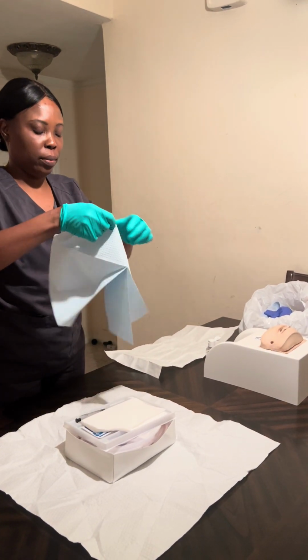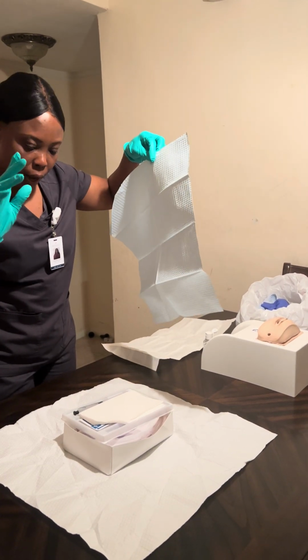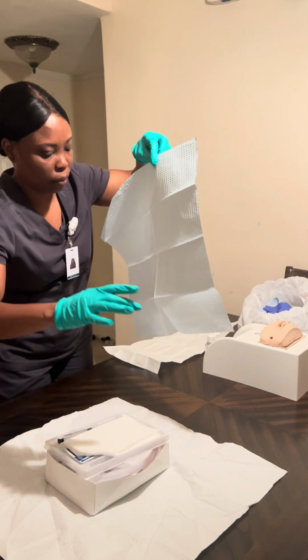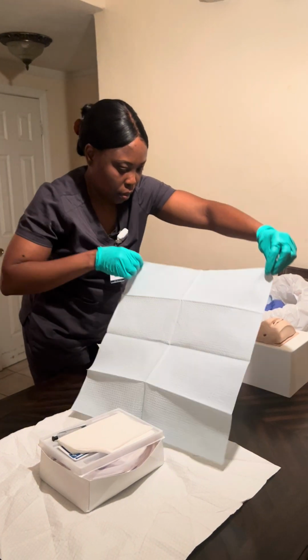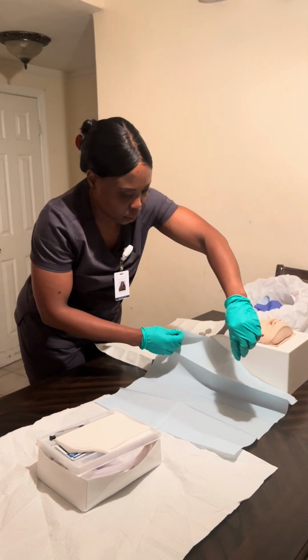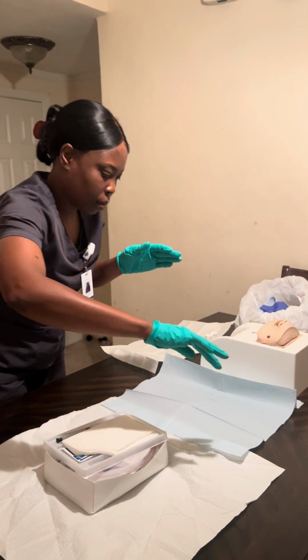I'm gonna open it with my hand. I'm gonna move a little bit here. I'm gonna put my tray with my clean hand, my sterile hand.